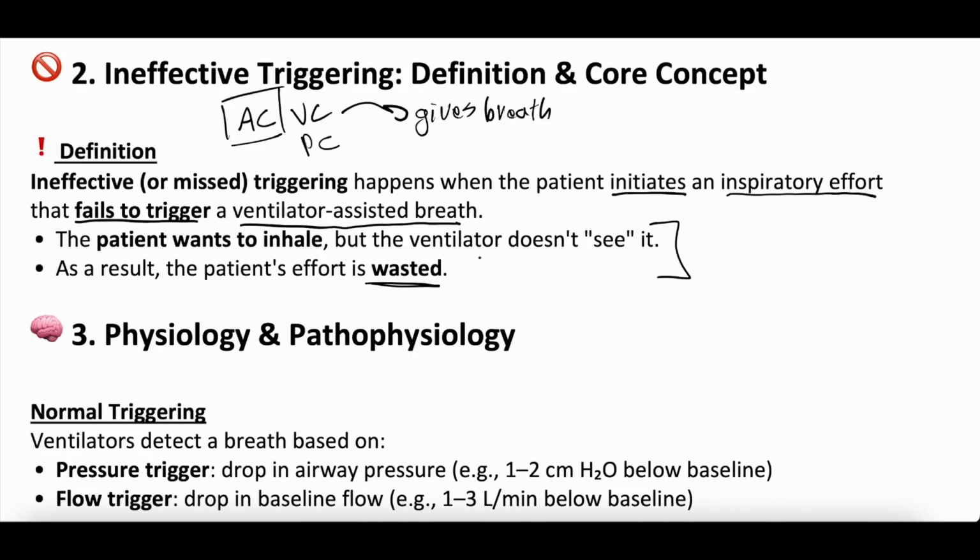So that's ineffective triggering, when the patient tries to take a breath in, but the ventilator doesn't recognize it, so it does not give a breath. That is an ineffective trigger.